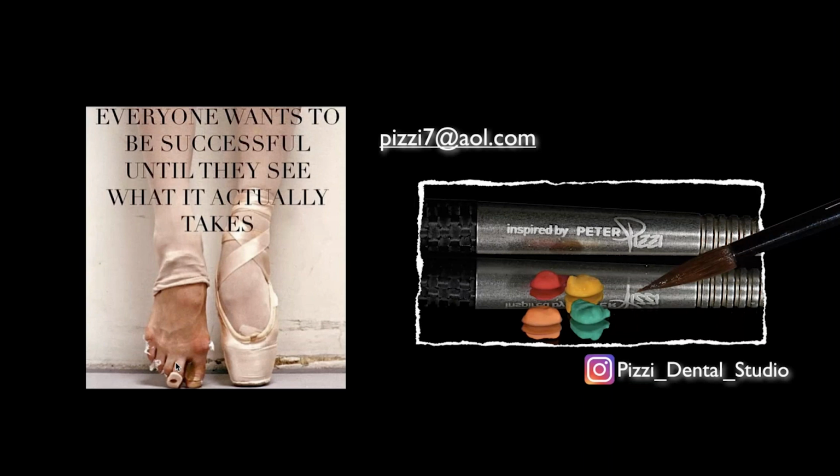All right. And then another question, do you always use Yellowstone? The models that you said, print doesn't really show the texture of the natural teeth, but do you always use Yellowstone, or does it matter? No, I mean, we've switched stones a lot over the years. I think some of those photos that you guys probably saw today was the old GC stone. We don't really use that one anymore when they changed formula. We do use our stones not necessarily just for color. Obviously, the color is useful. We're using an off yellowish taupey kind of color now.